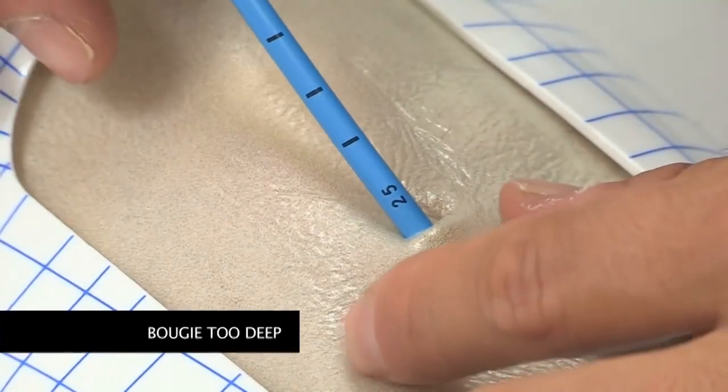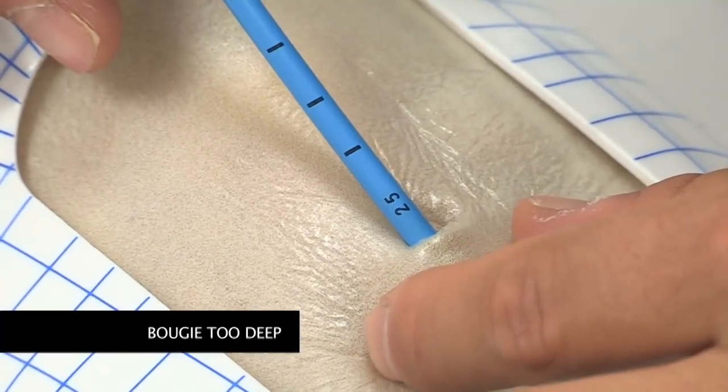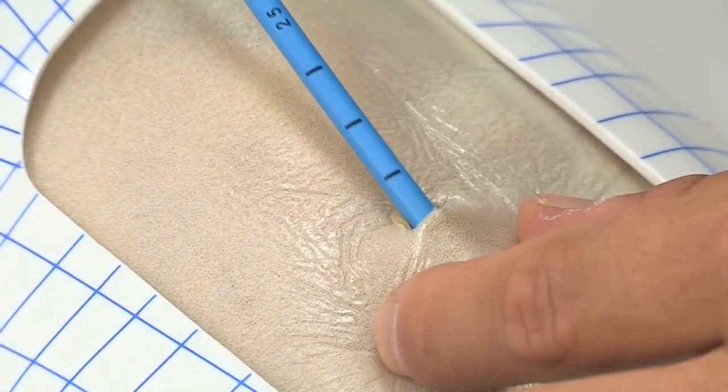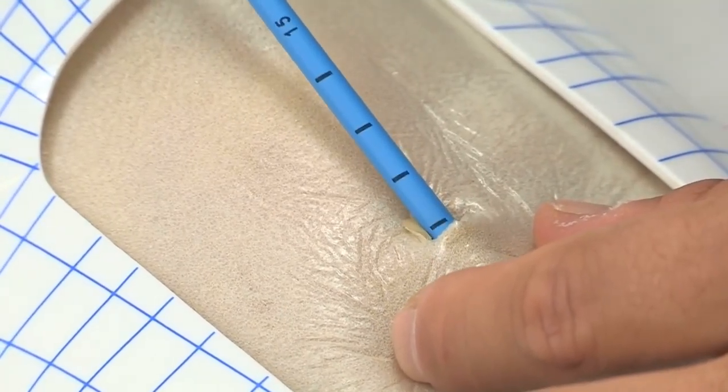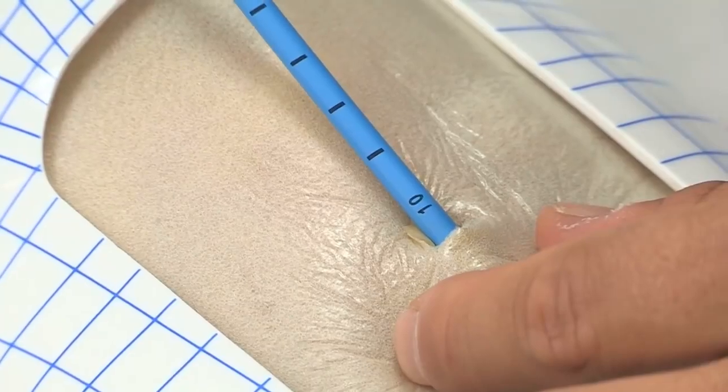Bougie insertion depth should be limited between 10 to 15 centimeters. If further insertion is required to identify correct placement, it is ideal to withdraw it to this depth prior to oxygenation or tube insertion.